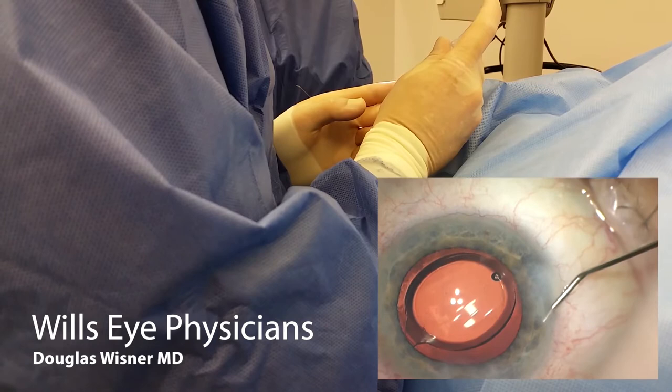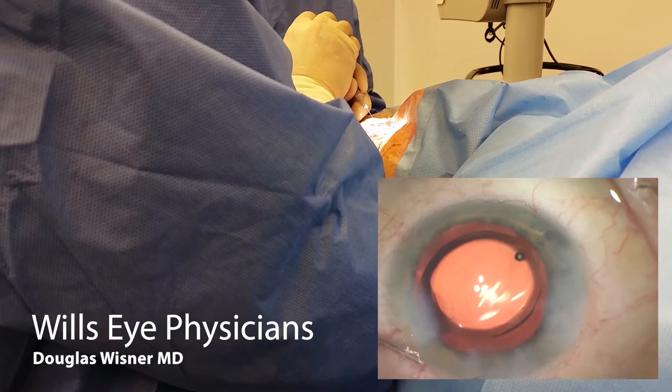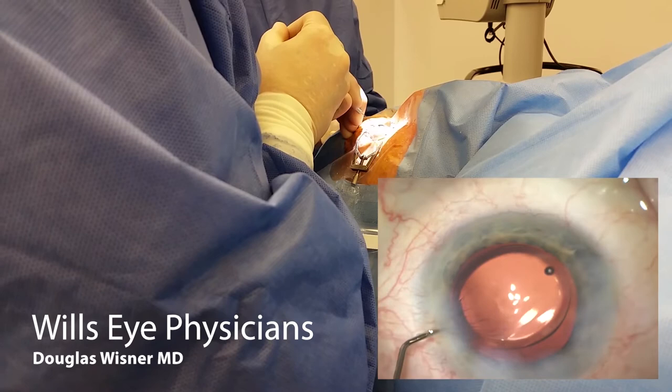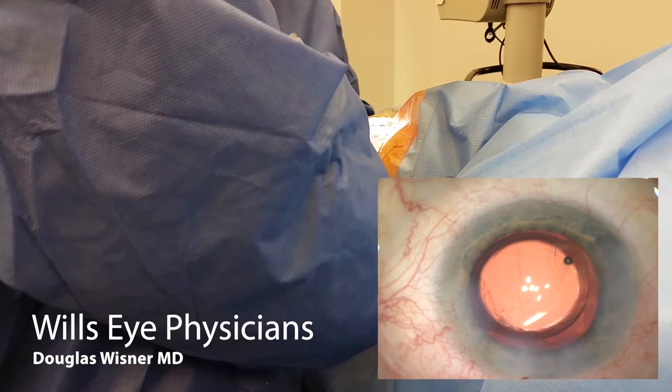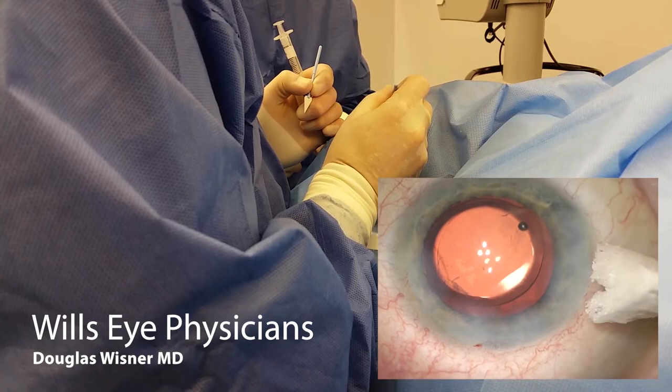Here I'm hydrating my paracentesis. When I'm doing bimanual IA, I do hydrate the paracentesis on both sides because you're working in it more and you can stretch the wound a little bit more. But the benefit is that the main wound doesn't require as much hydration because you're doing less manipulation through the main wound. Here I am doing final lens positioning, making sure I'm happy. I'm irrigating at the very end as I come out, checking the pressure. I'd rather have an eye that's a little bit firm than too soft; I don't want it to be sucking air. I make sure everything is watertight.